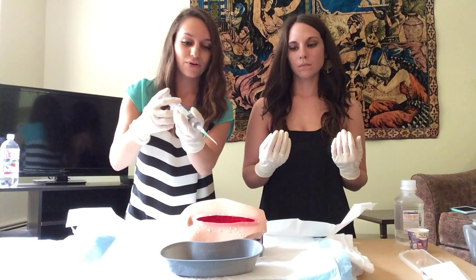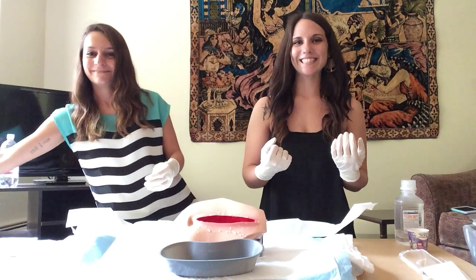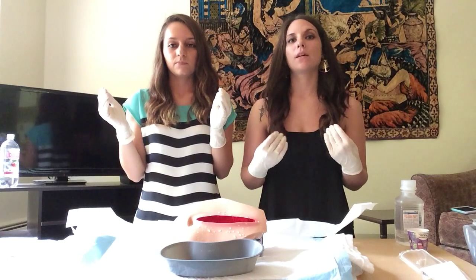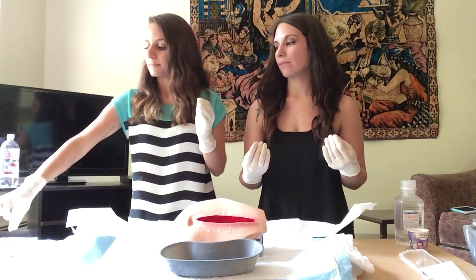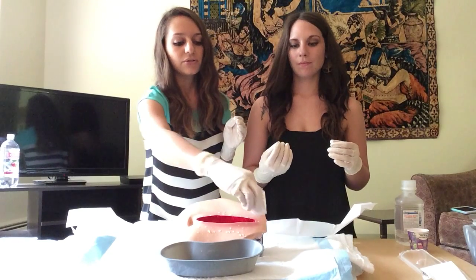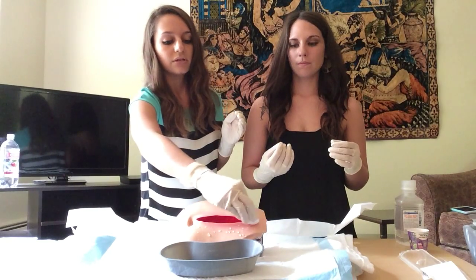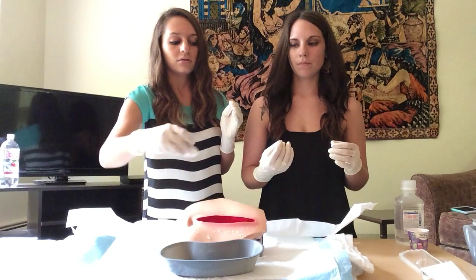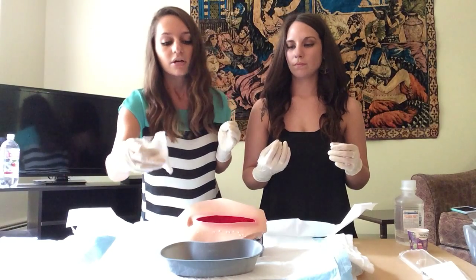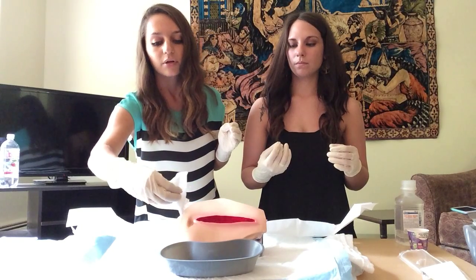That looks good. We're going to dispose of the syringe in the sharps container. After we have irrigated the wound, we are going to pat dry with sterile gauze from the sterile dressing kit, going right around the wound to remove that moisture, and wiping up any splashes around the abdomen.